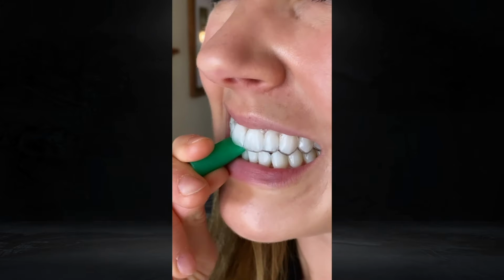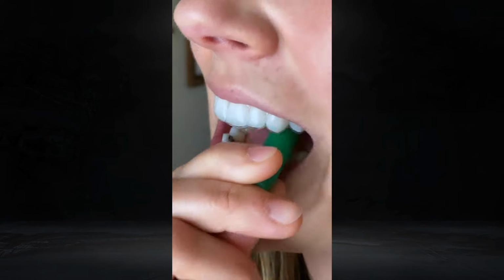Next, you need to use chewies. Most orthodontists will give these to you, but if they don't, you can order them on Amazon. What chewies are designed to do is to make sure your aligners are seated all the way in your mouth. So the common area that the aligners don't get seated is in the front. So you need to use the chewies across the front 6 teeth. And what I would recommend is that you chew and bite into each tooth every time you seat your aligner.